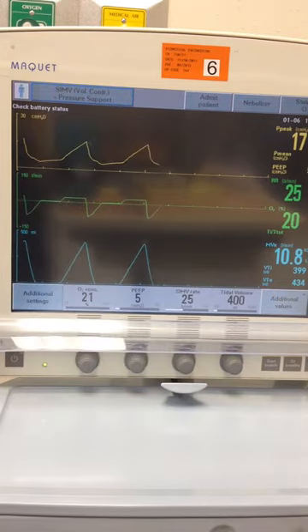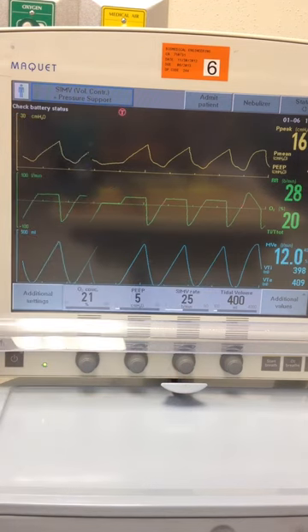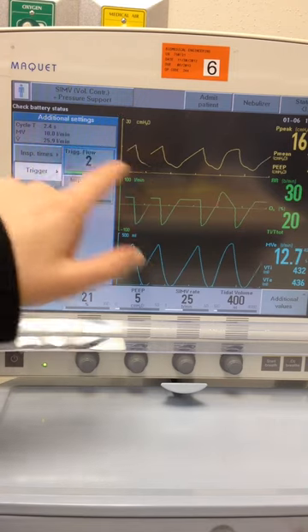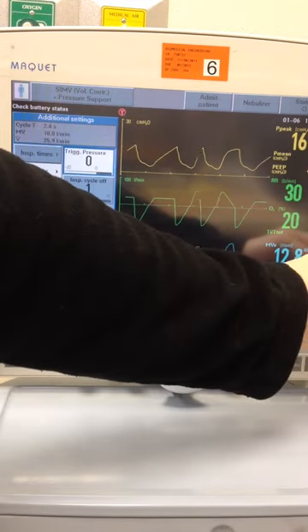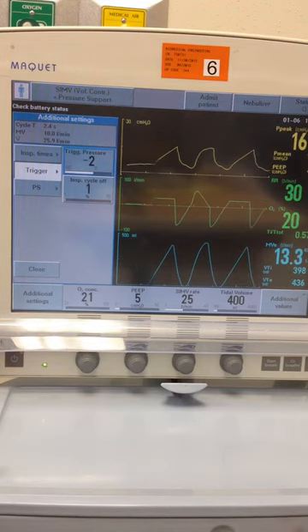Let's go ahead and accept our settings. We can see we are auto-triggering — there's that little T there — and our rate is set above 25. So let's adjust our trigger and take it to a pressure trigger. That looks to have corrected the problem.